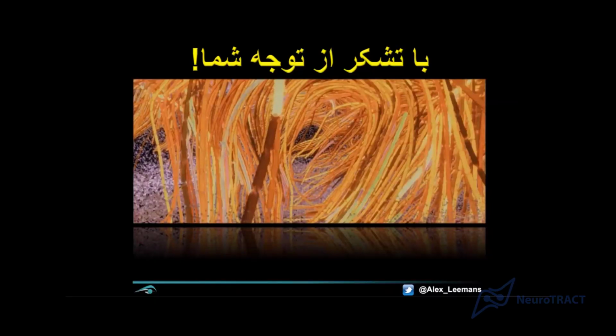Well, both, because with a surface-based one you're basically referring to the interface between white matter and gray matter, right? And the volumetric atlases, the way I see it, have regions of interest in the entire brain, and you could probably also compute the surface-based equivalent by saying this is gray matter, this is white matter, this is at the interface.